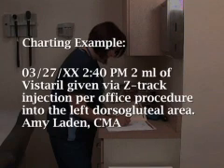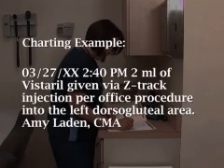Document the procedure. Include the date, time, medication, site, route, and amount administered. Follow office policy for recording the medication expiration date and lot number.